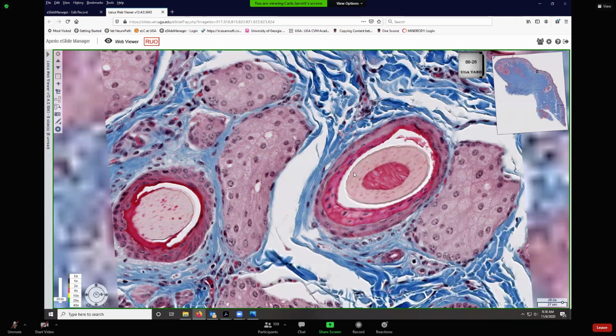So they oppose one another, which helps keep that hair in there. This is that lighter, more acidophilic staining, kind of airy, loosely packed keratinocytes that make up the medulla. So medulla, cortex, cuticle, then here's the cuticle of the inner root sheath, inner epithelial root sheath, external epithelial root sheath, glassy membrane, and then dermal root sheath.